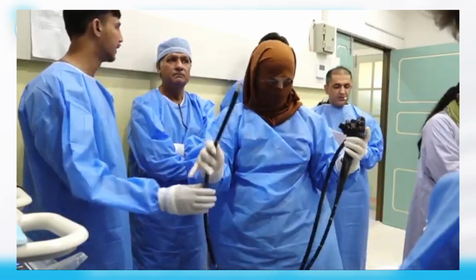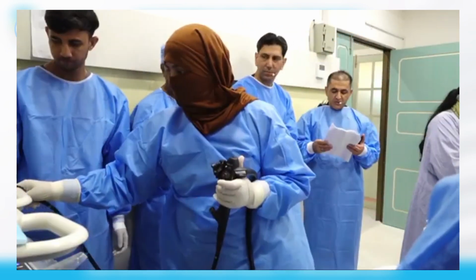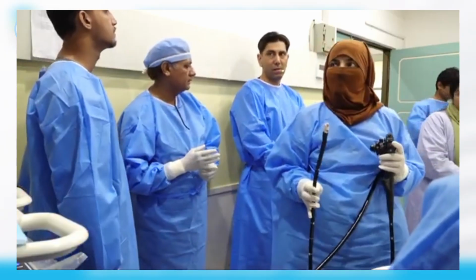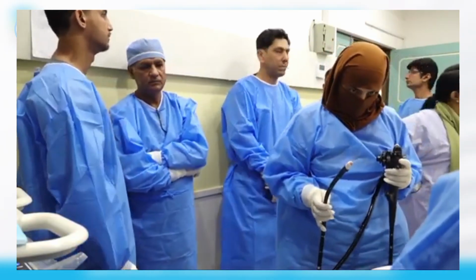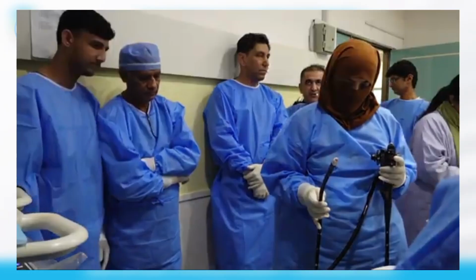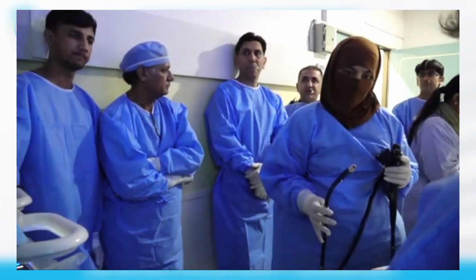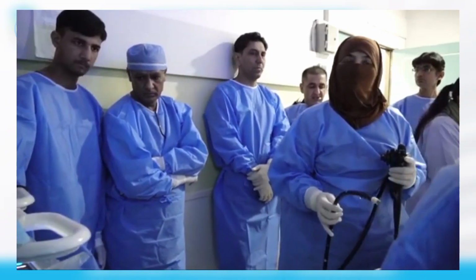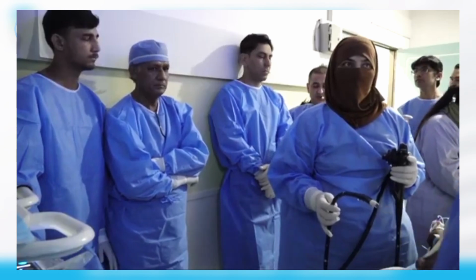Assalamu alaikum, sir. We have a 65-year-old male patient, a biopsy-proven, US-guided biopsy case of adenocarcinoma of the pancreas. We had a CT scan done that is showing mediastinal lymph nodes. So our aim is to assess the mediastinal lymph nodes, whether they are metastatic or benign. Hb is 12.2, TLC is 19, and LFTs: total bilirubin is 2.8, SGPT is 98, and ALP is 150.